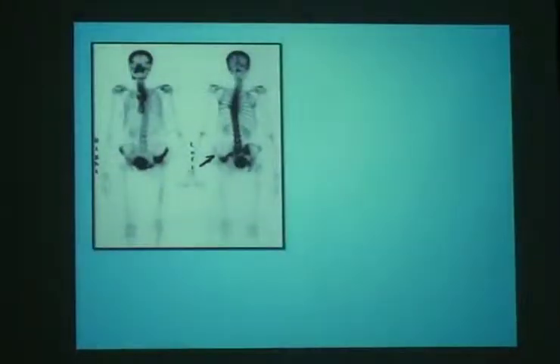Then we've got, this is an osteolytic lesion attributed here. Now there is an area of photopenia seen. What helped in this visualization of the lesion is the asymmetry between both iliac bones. We can see here the rim, the blade, while here it is indistinct, and then we've got this definite osteoblastic reaction.